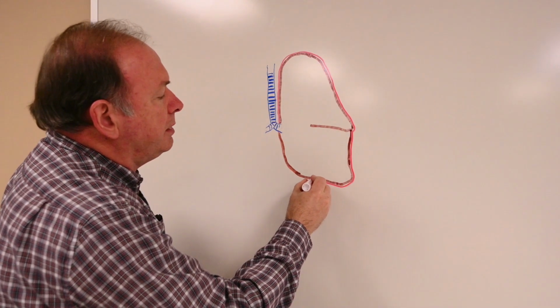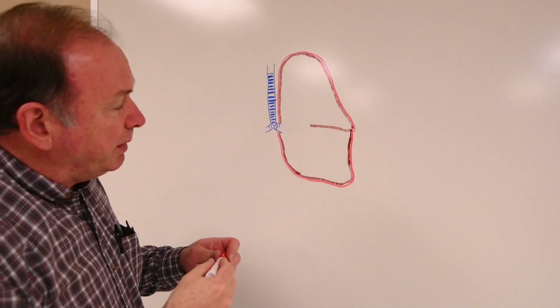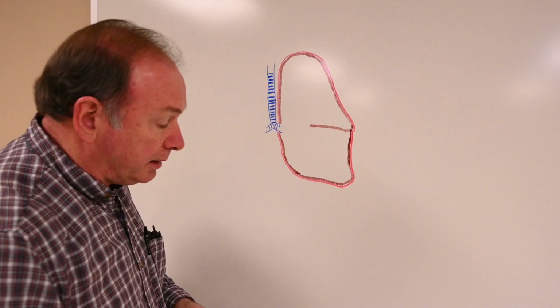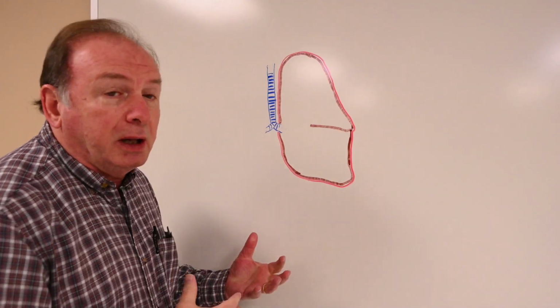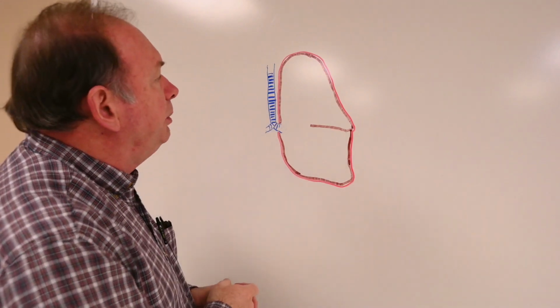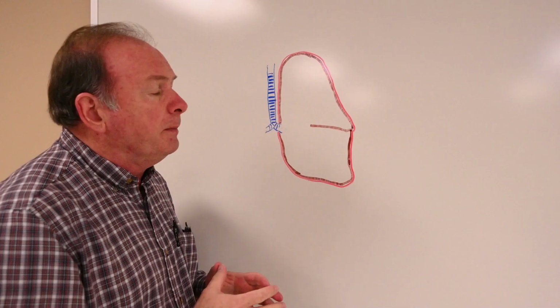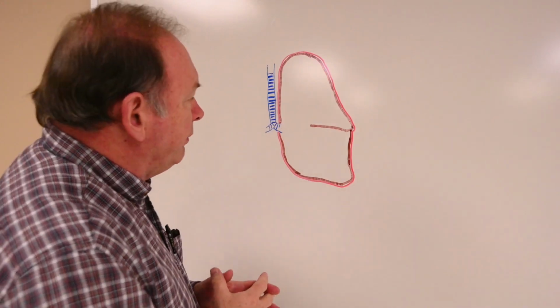So all around the lung, we have this capsule with the mesothelium, that outer covering, that visceral pleura layer of the lung. So we'll look at that under the microscope here a little bit later, see the mesothelium and the connective tissue that make up that outer layer, the visceral pleura of the lung.